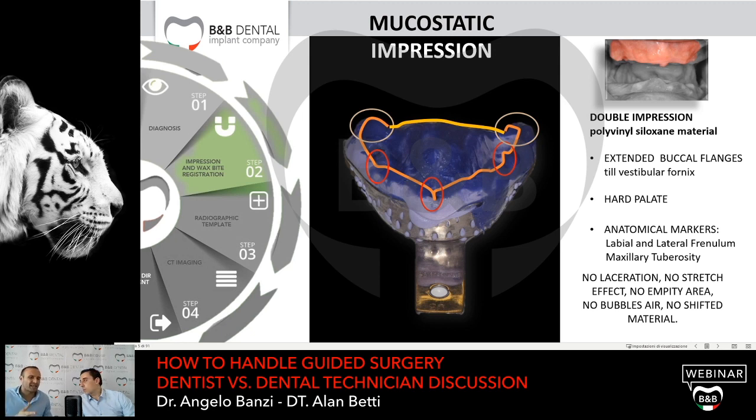Just another point that I want to share with you is when I take the impression, it happens that sometimes I've got some bubbles, or maybe an empty area, or some material shifted away, some laceration, or maybe the impression is stretched. All these details, we can say that are errors, compromise my impression. My question is, do I have to take a new impression, or sometimes can I avoid taking a new impression and use that impression?